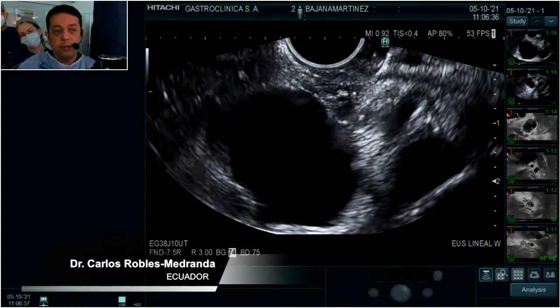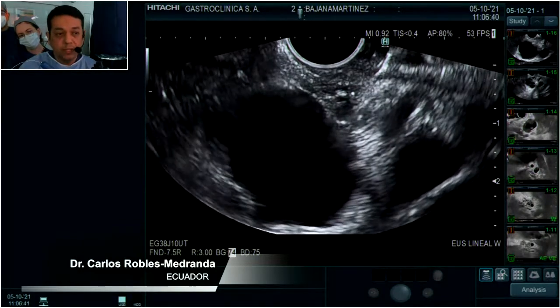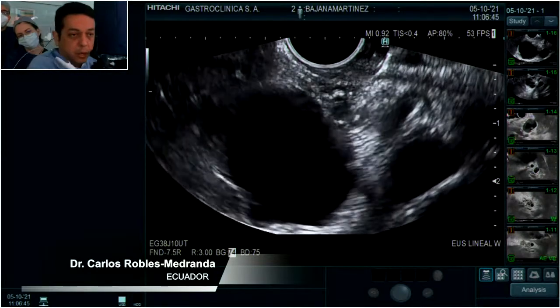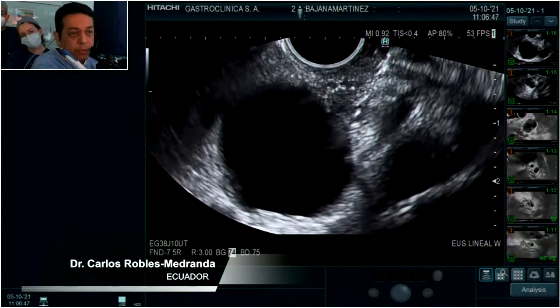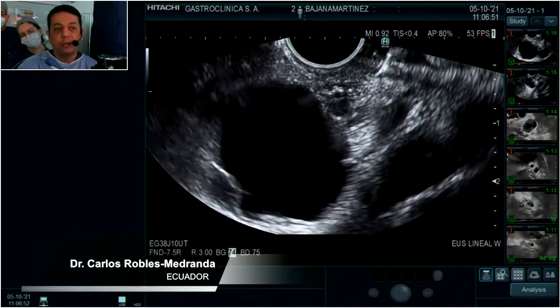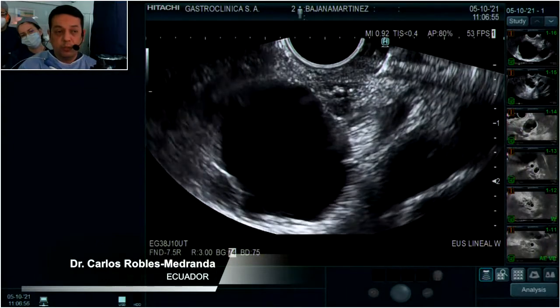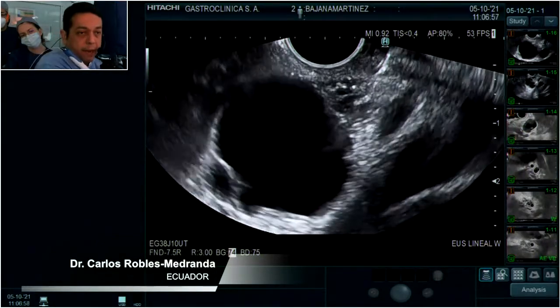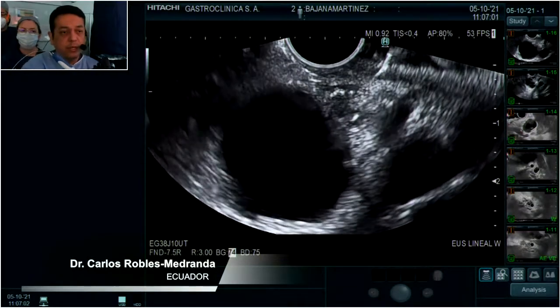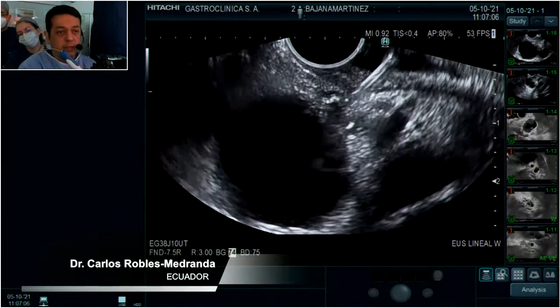However, in our practice in this institution, if we see a mucinous cyst lesion or potential malignant lesion, we will take a biopsy using Moray biopsy forceps through the needle. So we will start our evaluation using confocal first, and regarding the characteristics of the lesion, we will take a decision on what is the next step to have the best diagnosis of this lesion.